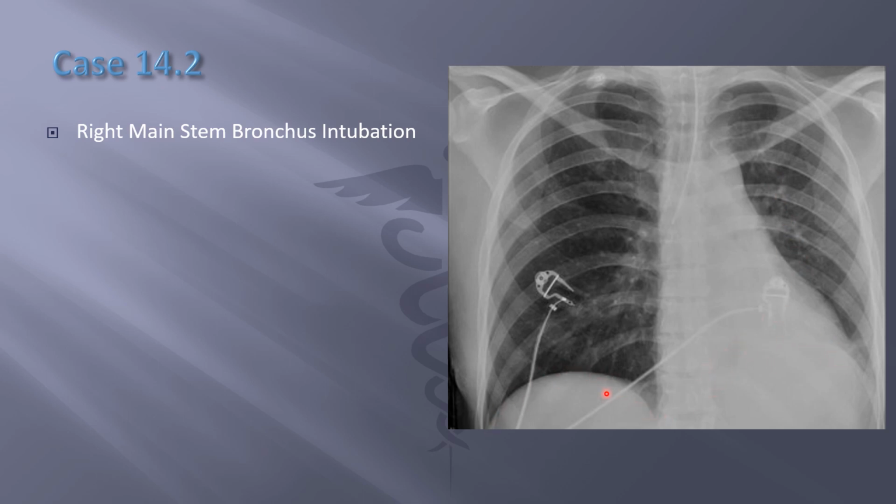So you want to retract this out so now air is evenly distributed to both sides, and this diaphragm will come down. This lung will reinflate and then it will come down.